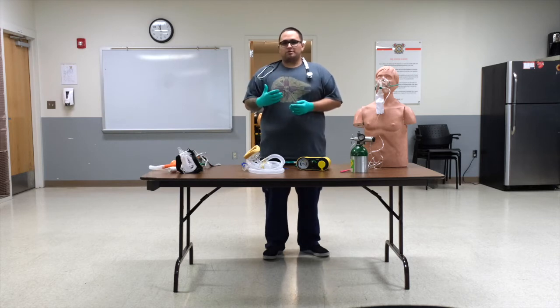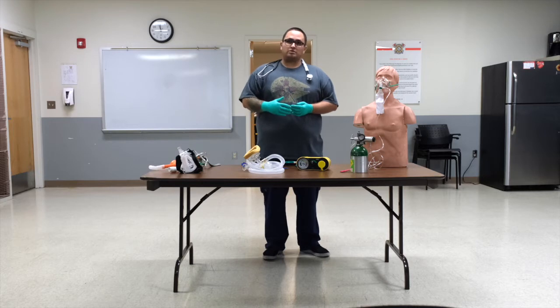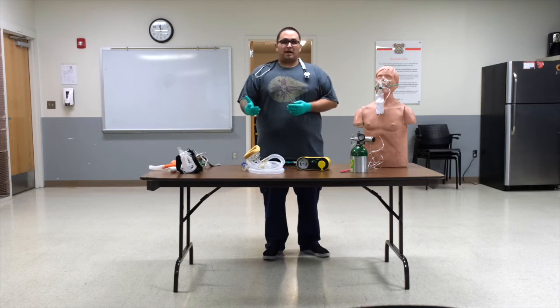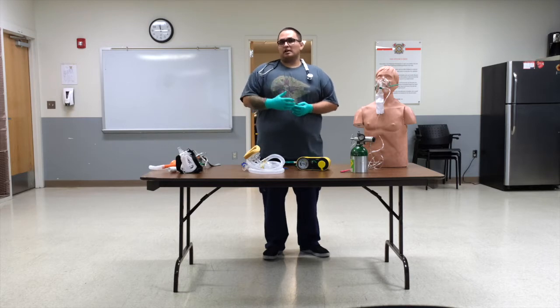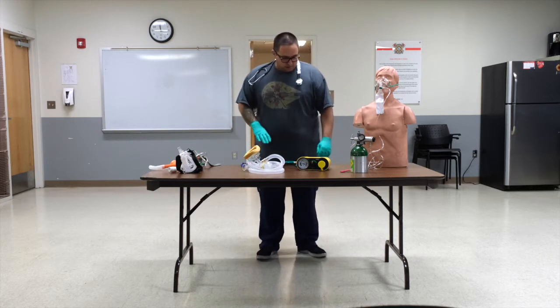CPAP is positive pressure, so once it's hooked up to the oxygen tank, it's going to be providing a constant positive pressure into the lungs. It feels very uncomfortable for a lot of patients. Patients who have sleep apnea, that are on BiPAP every night when they're asleep, are a little bit more used to this. But an average patient that is not on these types of devices, this will feel like they have their head sticking out of a car window going about 60 miles an hour down the highway. So setting up the device itself is actually pretty easy.